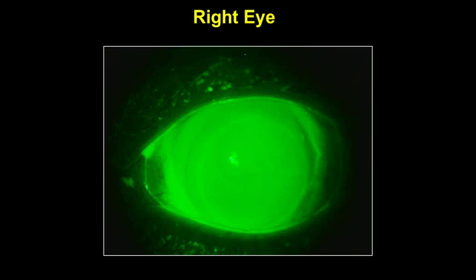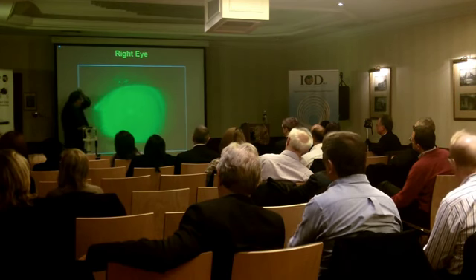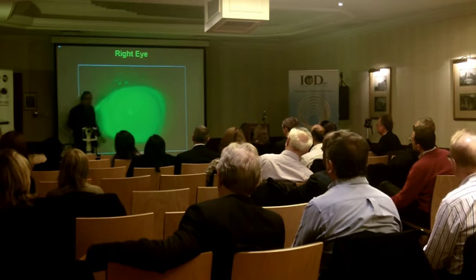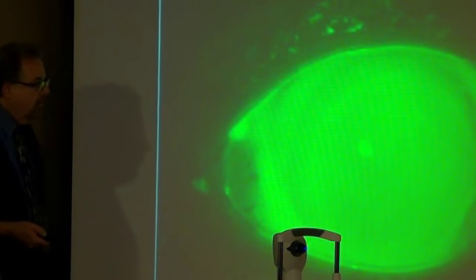Here is that actual contact lens. You'll notice that we've now cleared that area up on top. We now have cleared the area down below. So this is really what you're ultimately looking for.